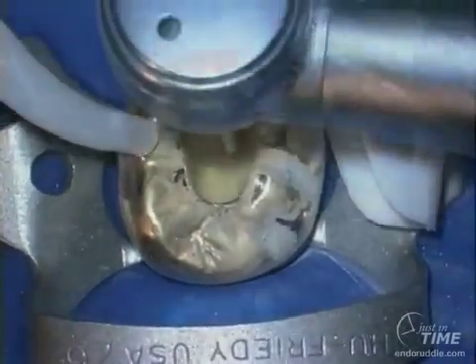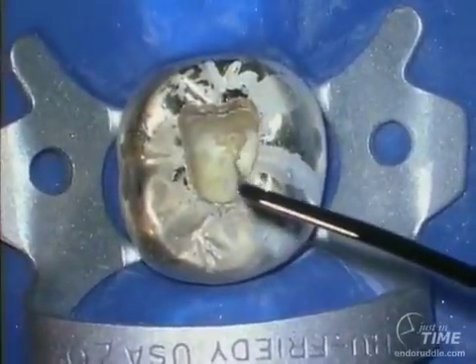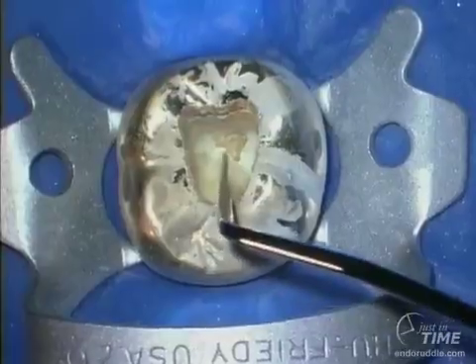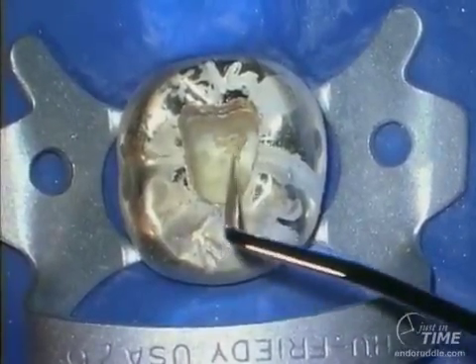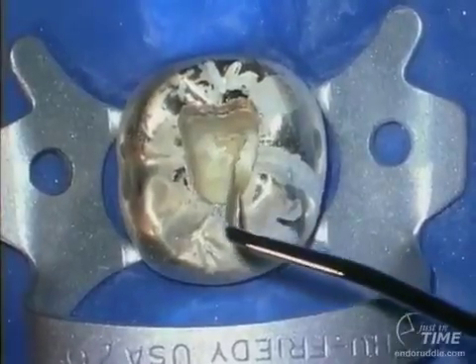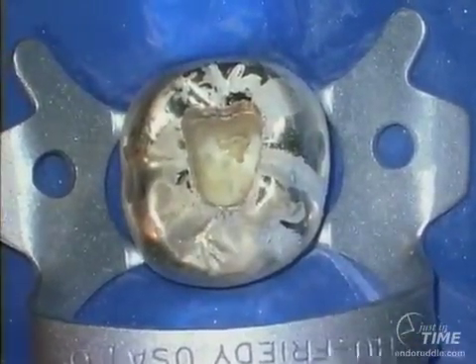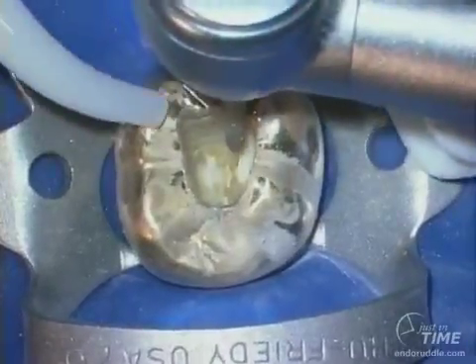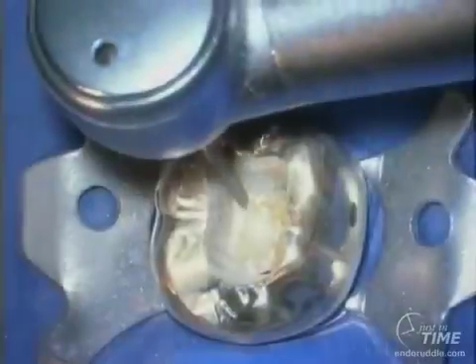Notice that this is a large stone I'm uncovering and my burr doesn't actually fall into a pulp chamber. Mapping this stone, you can begin to see it's quite large. It's immobile. It's going to require some resection to free it up.